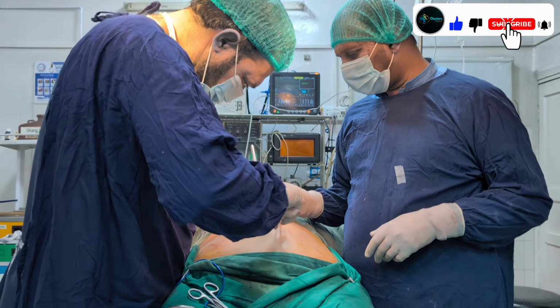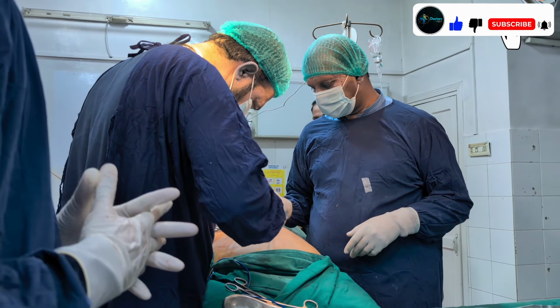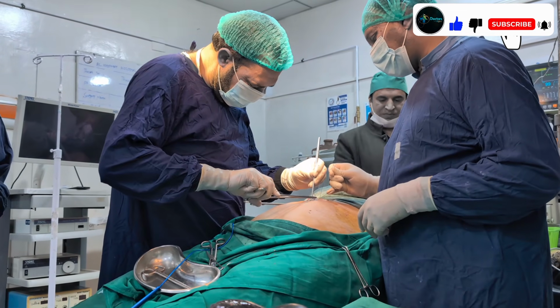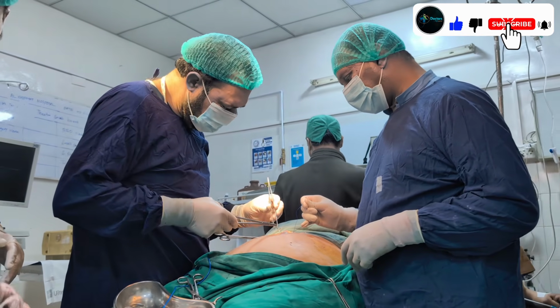As you can see, the cyst is placed on the trolley. It is extremely large. Now the patient will finally feel relief, recover well and be alive for normal life again. After surgery, the pain will be gone and the patient will be able to breathe easily and relax.